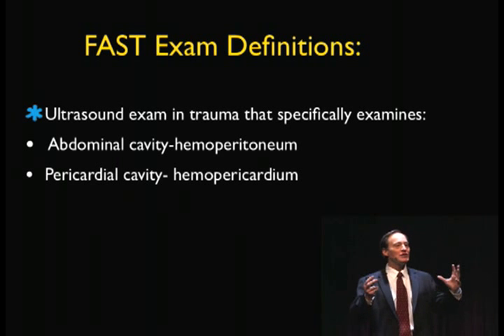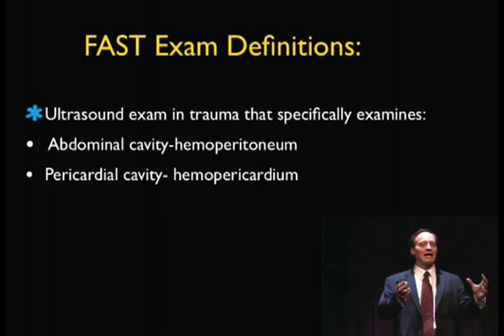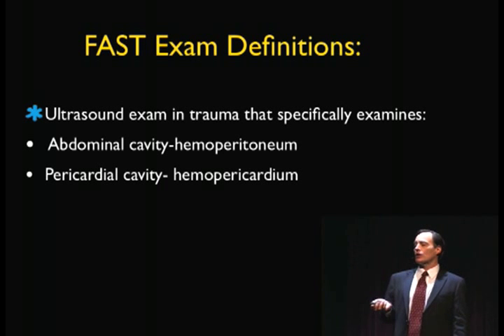You need to know, does my patient have a huge blood clot sitting on the heart? Do I need to get the surgeons to come in and take that off? Do I need to do a pericardiocentesis? So we're going to look in the pericardial cavity.